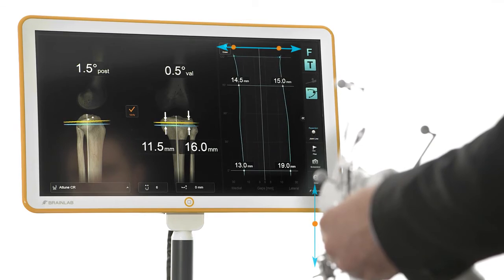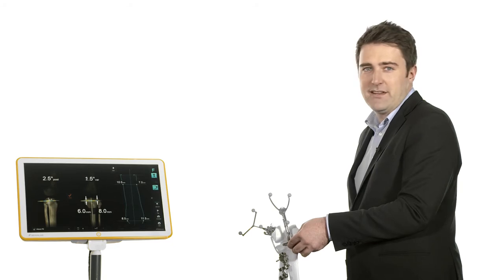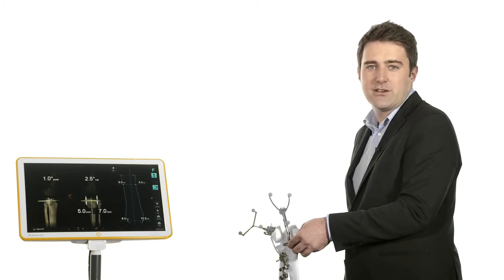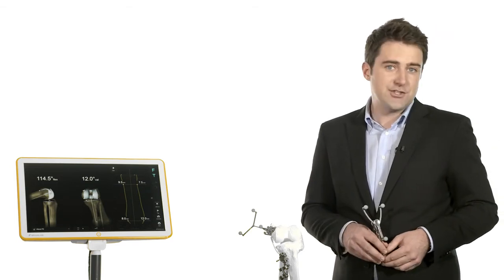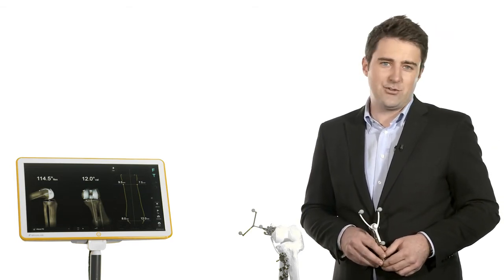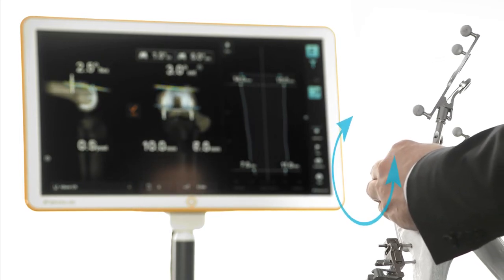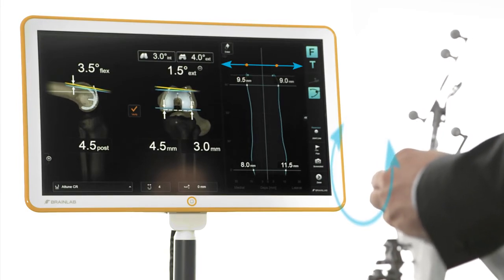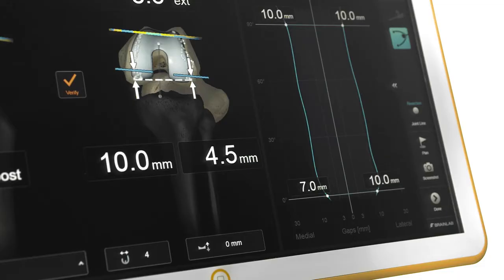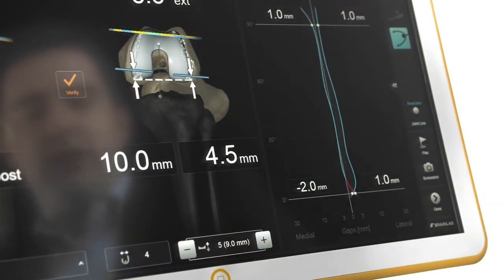This patient-specific navigation allows the surgeon to foresee the outcome of final joint stability based on the implant geometry and according to previously verified cuts. Surgical interactions such as soft tissue releases are immediately taken into account. Finally, when performing the anterior cut, the software shows how rotation of the cutting block will affect final stability. The goal is to achieve two parallel lines indicating symmetrical stability of the joint. By selecting the insert thickness, the graph drifts to the zero line.